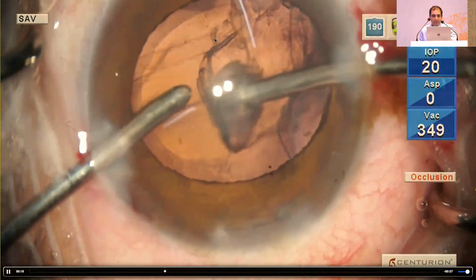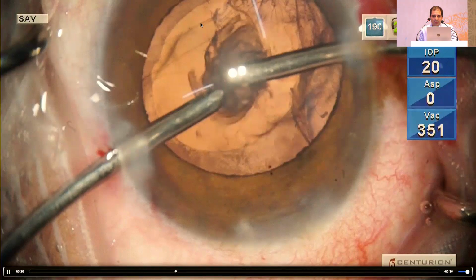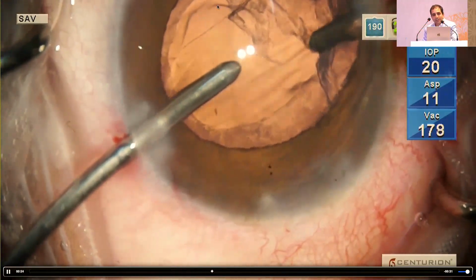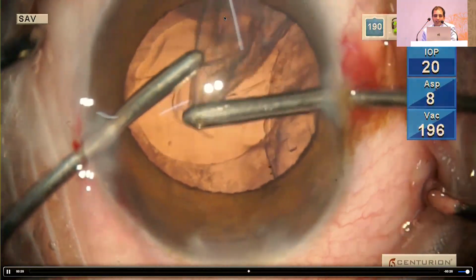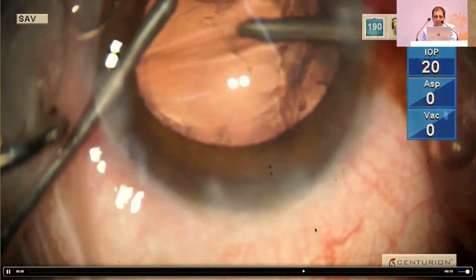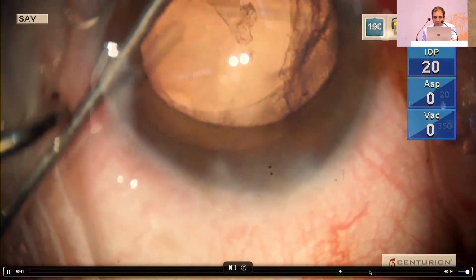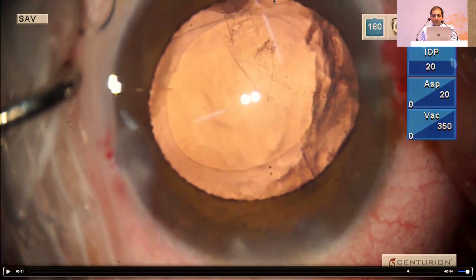So this is already a warning sign appearing. The rhexis is intact, but this is a very, very clear area, and you can notice some shadows appearing as well. So definitely the capsule has been breached in this area. And the surgeon is still a little oblivious of the fact that this event has occurred, and things are going off as per routine. Finally, it seems that things have been noticed.